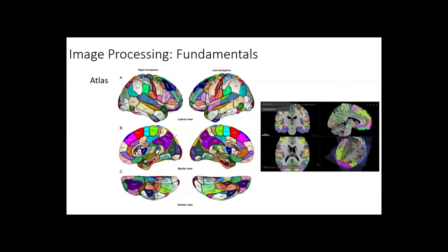So if you do an MR scan and we want to do a diagnosis based on your MR scan, we need to first segment the brain, and then study the shape and the volume of each region. To do this, we need to populate these labels on the new brain. So what's the technology we need? Image registration.